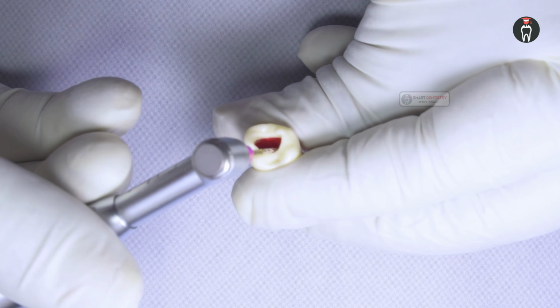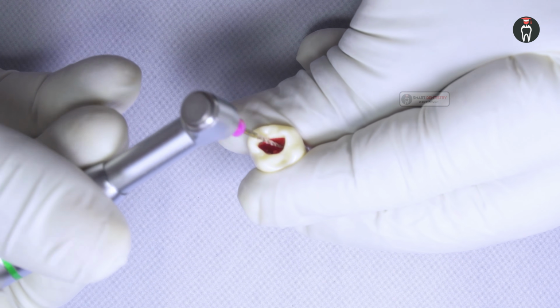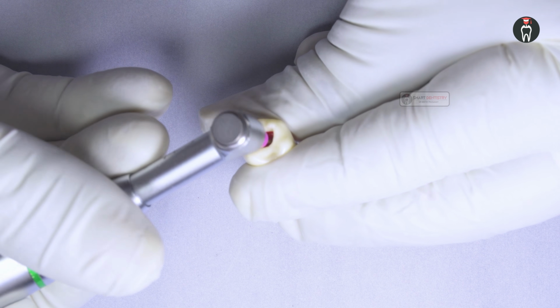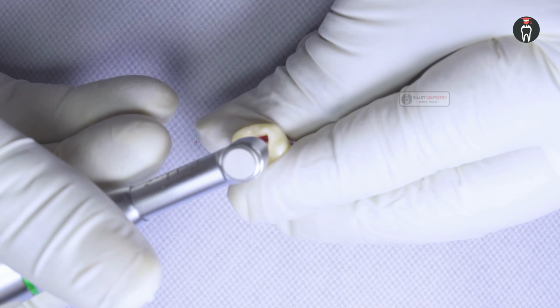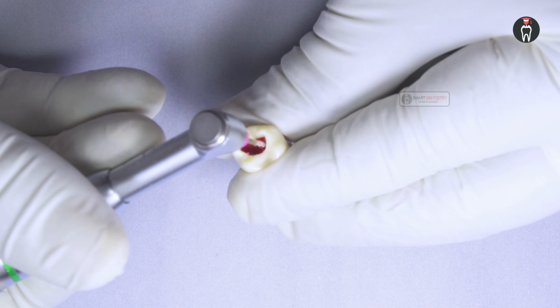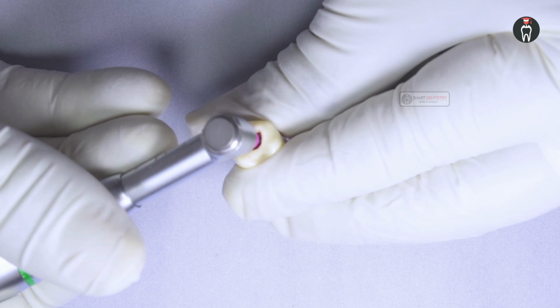If you are using a ProTaper system, the shaping files are supposed to be used in a brushing motion, and the finishing files are supposed to be used in a pecking motion. If you are using a shaping file in a pecking motion, it will get screwed in.